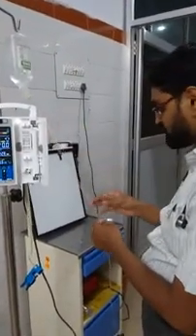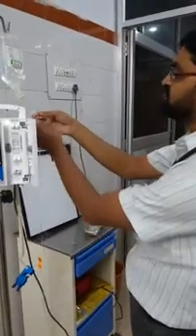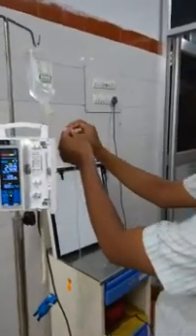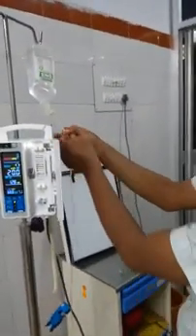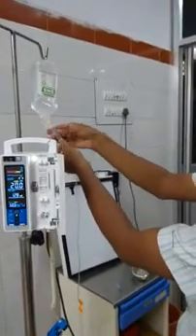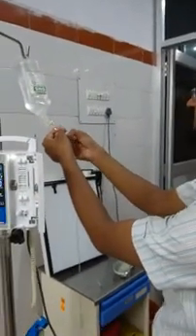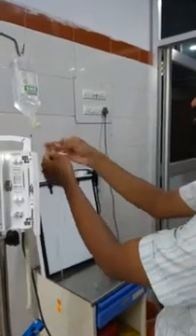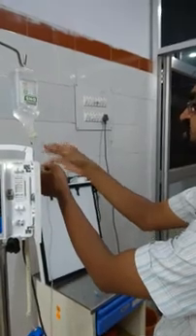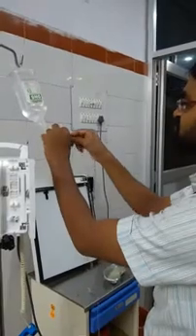So all the micro drops will go and accumulate just below the drip chamber, where again with a bit of percussion they will all coalesce, and now I have to just tap it here. So they will mix nicely. If this step is unsuccessful, then we have to flush the entire content, but that will again cause the wastage of the drug or the solution.